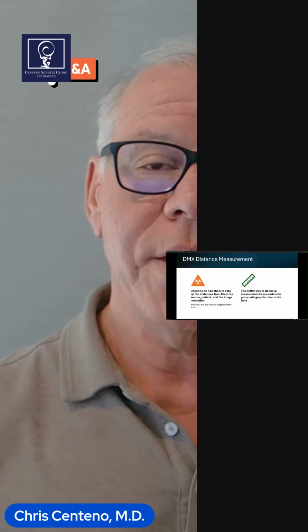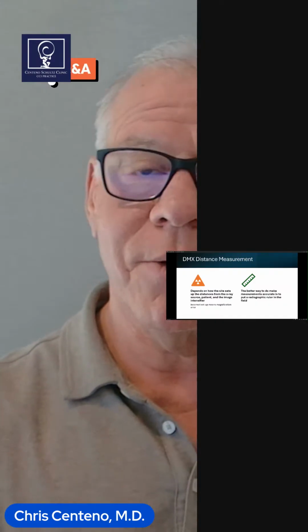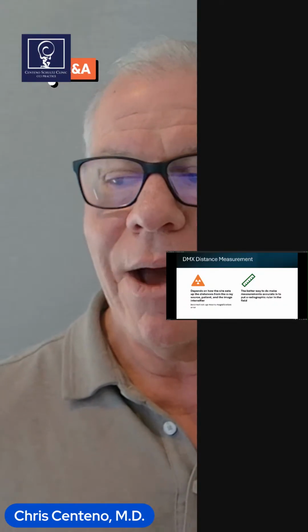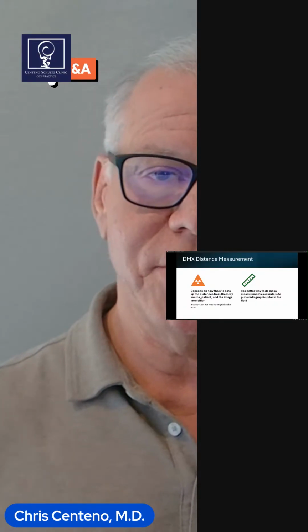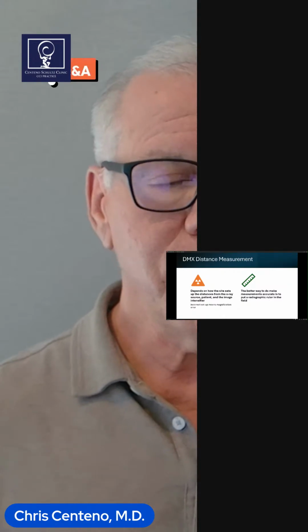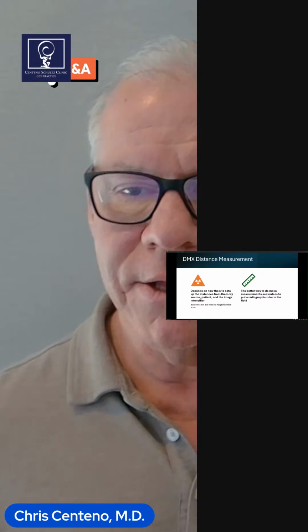And so what you think is 1 millimeter isn't really 1 millimeter on the film or the video you're measuring. Now, a better way to do these measurements is to use a radiographic ruler in the field, which is what we're doing at CSC. So I'll show you what that looks like.